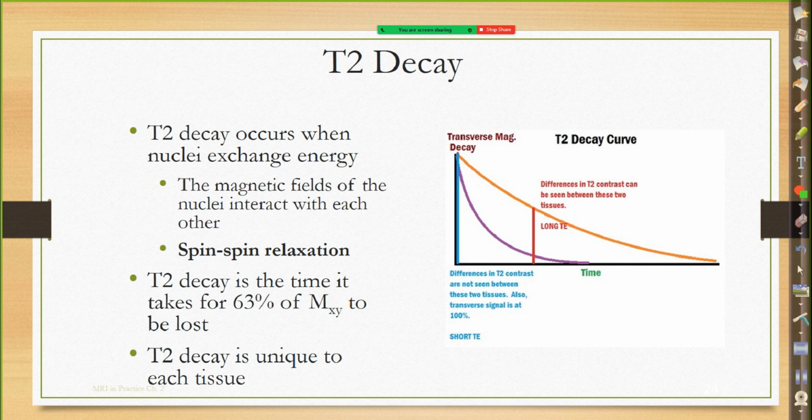All right. So we've talked about T1. Now let's switch gears and talk about T2 decay.